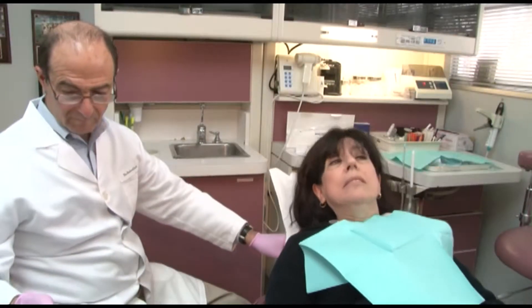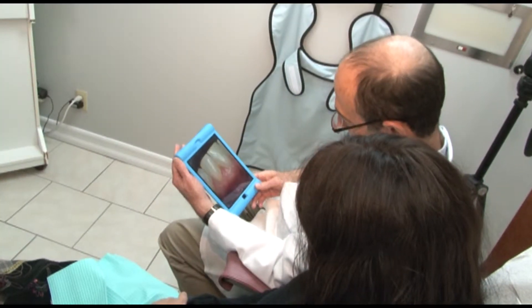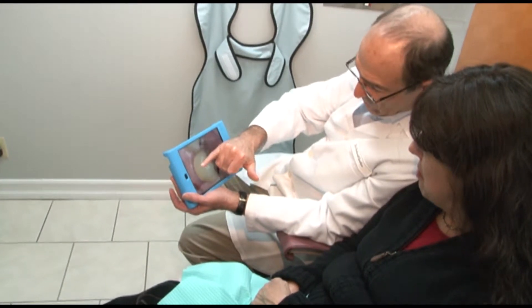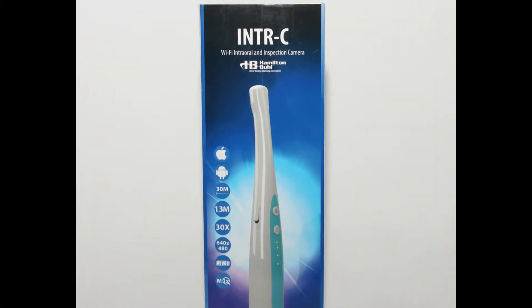Attention dentists and oral care professionals looking for a high-tech, remarkable solution for patient care and education — one that helps your patients visually understand their dental issues and makes photographing dental images a snap. We've got the answer: introducing the Hamilton Buhl intraoral camera.